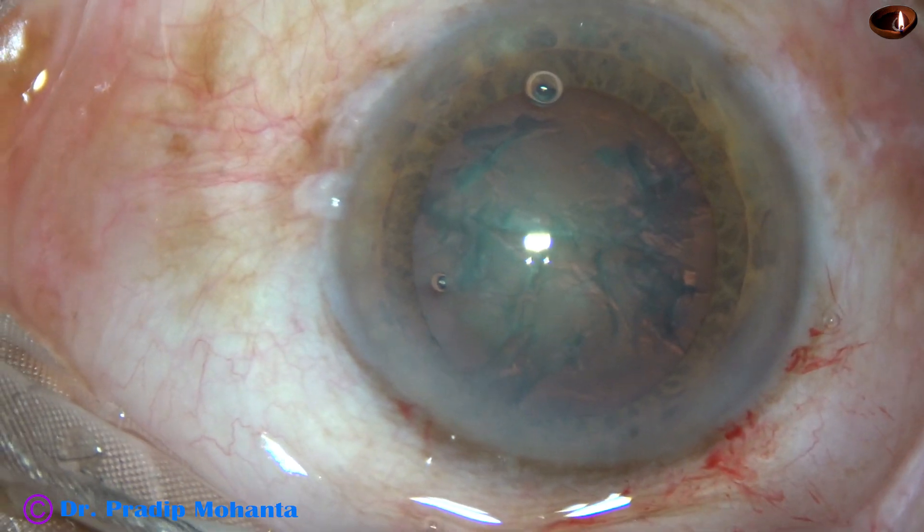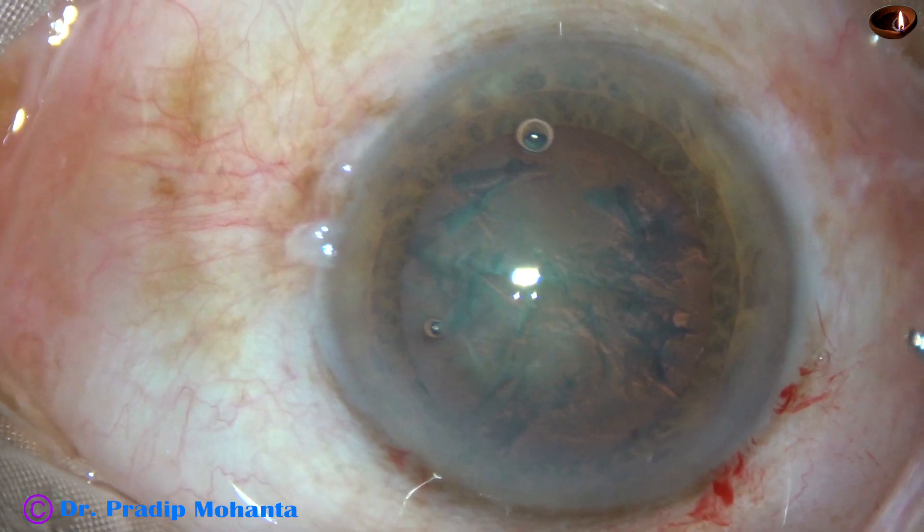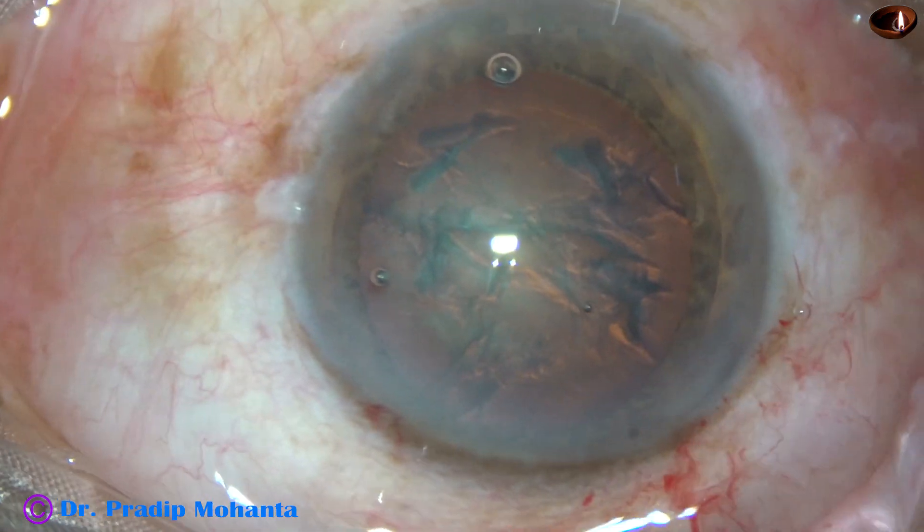The nucleus rotates nicely. And now the anterior chamber is filled up with 2% HPMC.